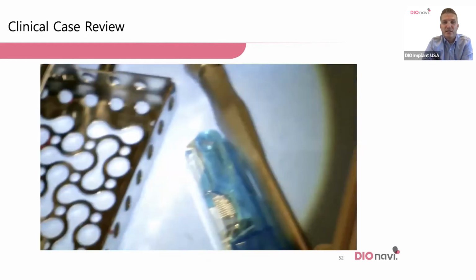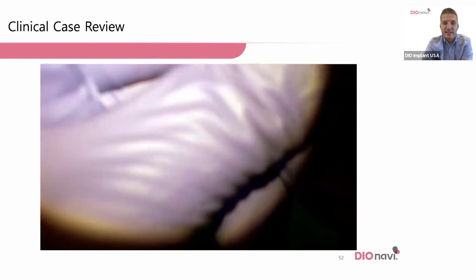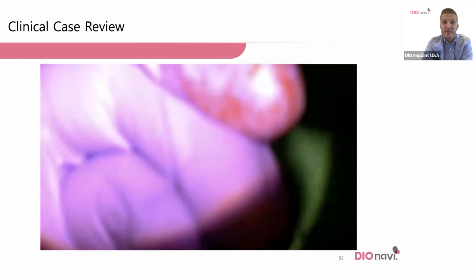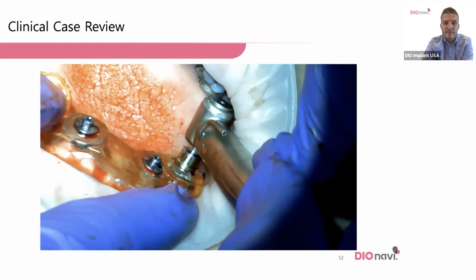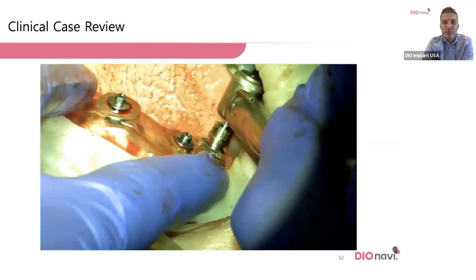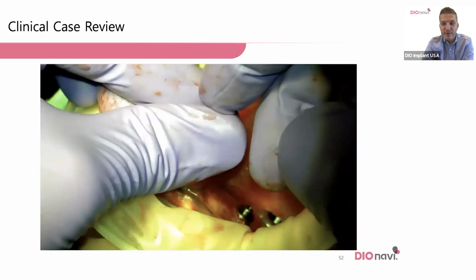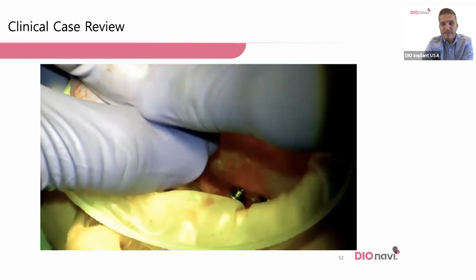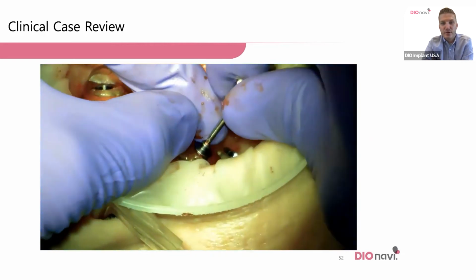And this next one is the one that's actually going to push through, if you will, and actually gain access to the sinus cavity. And so this is a little bit longer drill or just a shorter depth stop that does the same thing for you. And you'll probably see this kind of push and drop. Not so much of a visual there, but now I know I'm in the sinus per the drilling protocol. Obviously, when you irrigate, I don't want that needle tip pushed very deep into the sinus cavity at this point. Just barely put that in, just a little irrigation. I'm removing these fixed pins to remove the guide so I can do the hydro lift here in just a second.